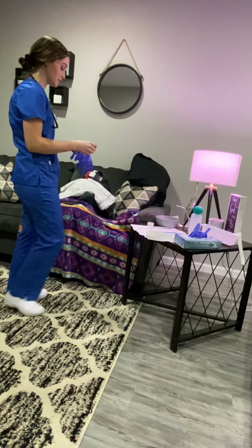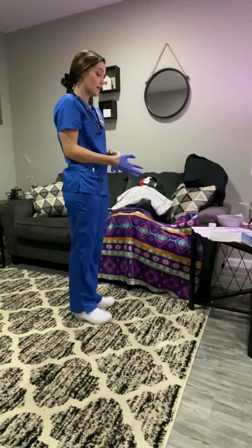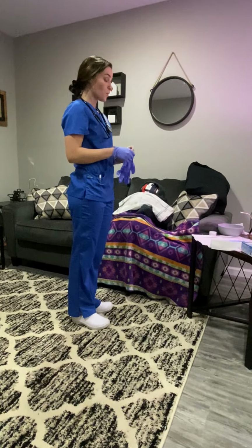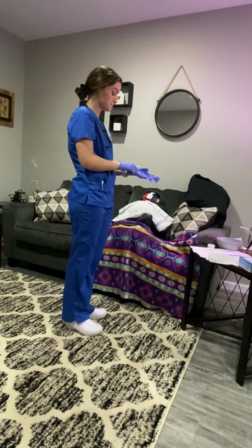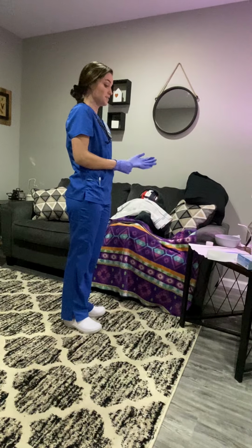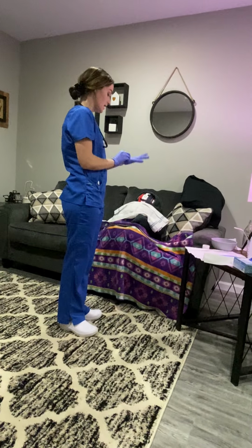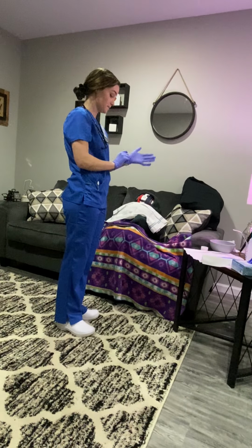I'm going to tell the patient of feelings that she may feel when I'm inserting this tube. I'm going to let her know that the sensation of choking or gagging will go away after we pass the oropharynx. I'll let her know that if she experiences any major discomfort, to tap her index finger to let me know that something's wrong and to stop.